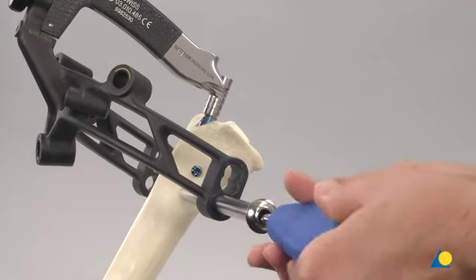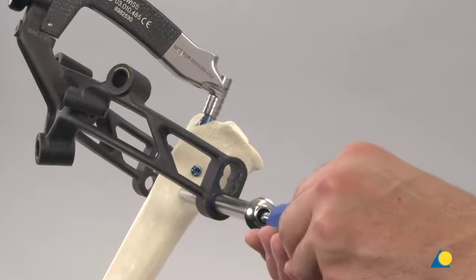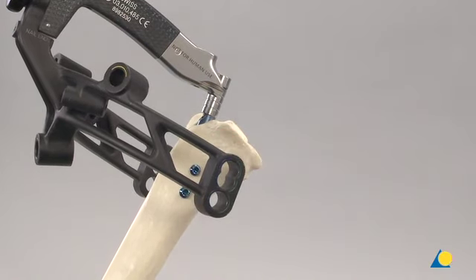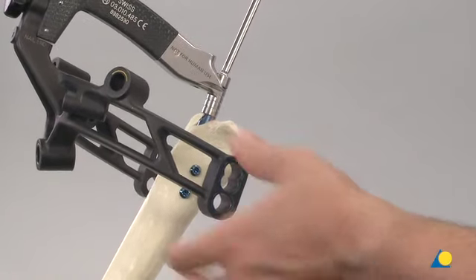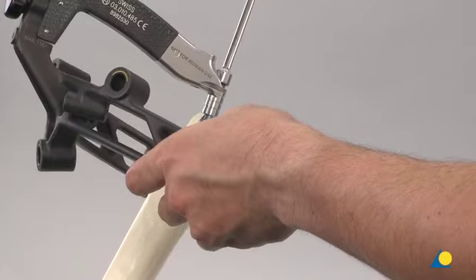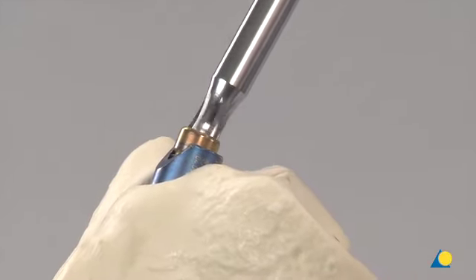Using the hole marked Stat 1 in the aiming arm, the screw insertion sequence is repeated for the second proximal mediolateral locking screw. The screwdriver, hexagonal 8.0 mm diameter, with spherical head and T-handle, is used to loosen the connecting screw so that it can be removed together with the insertion handle and the aiming arm. The 0 mm end cap is inserted as described previously.